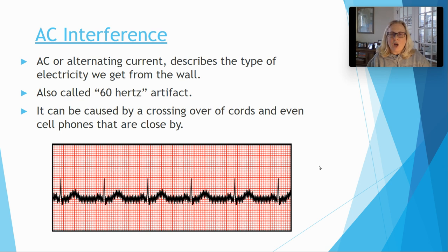If it's like at the hospital, if they have a breathing machine, some of them, the blood pressure cuff goes off and the sticker's close to the blood pressure cuff. If they have those booties they put on their legs to inflate and it keeps the circulation going. So that's some of the things. If the machine goes off and buzzes and makes a vibration, it's going to cause this as well. So you just make sure nothing's there. At school, it's going to be a cell phone or it's going to be the wires are just so tangled. You have to untangle the mess before you start.